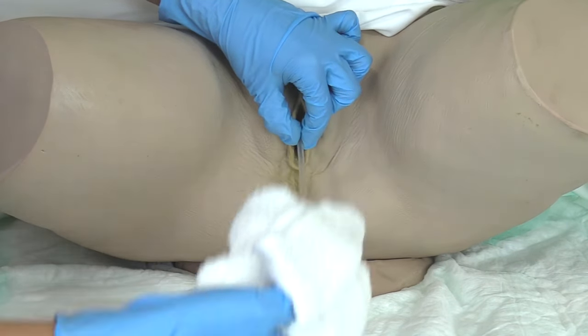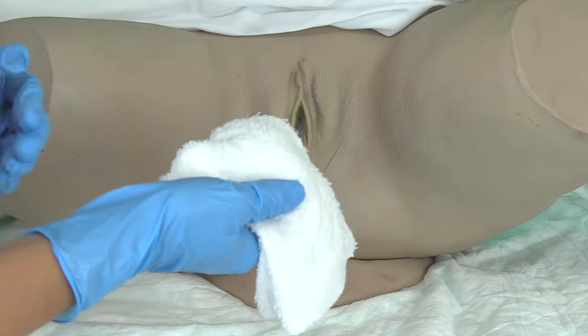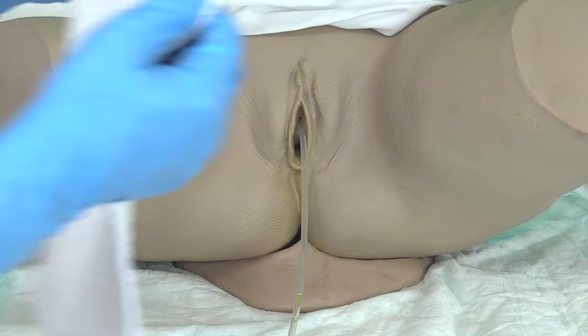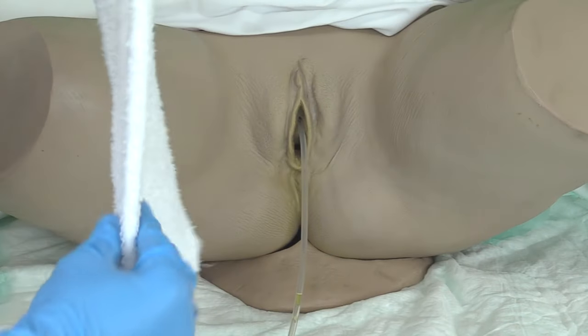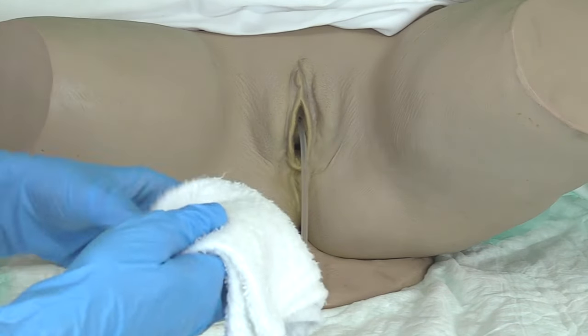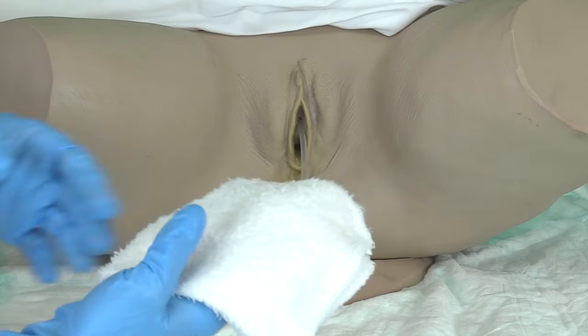And now what we're gonna do is discard this, get a new cloth, and rinse. Now we have a new cloth with just water on it. Again, we're going to fold it in half, creating those 4 leaves. And now we're going to rinse those same places that we cleaned with the soap and water.